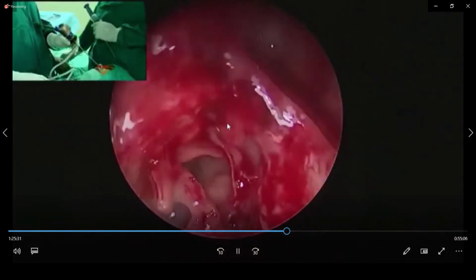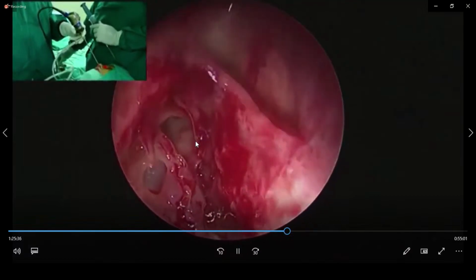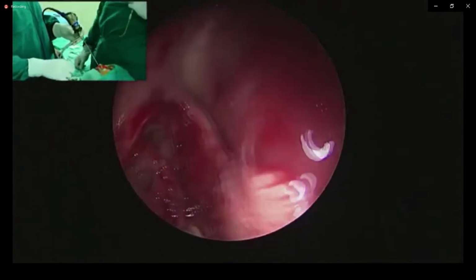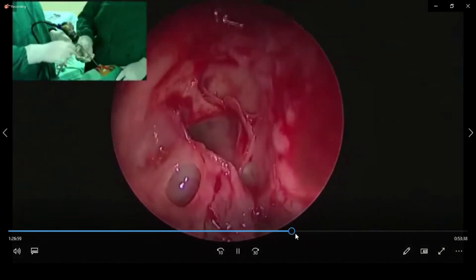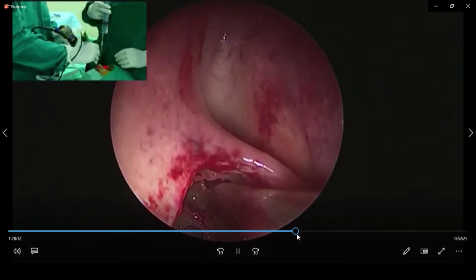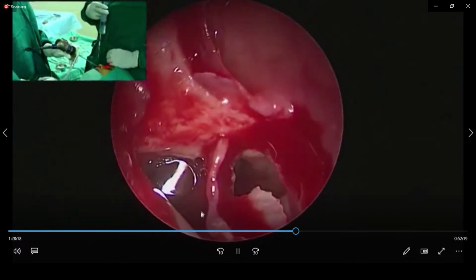See this? This looks like frontal sinus. Can you see? Yeah. There are so many openings which can confuse you. That's why I picked up this case for you. CT scan is the key which tells you which cell is medial, which cell is lateral, which cell is going up to obliterate the frontal sinus drainage. Now see one by one. Which is frontal sinus, which is which cell? See this? I am going behind this cell. I told you this is the cell. See, this is type 3 cell. Yeah. And the frontal sinus is medial to it.